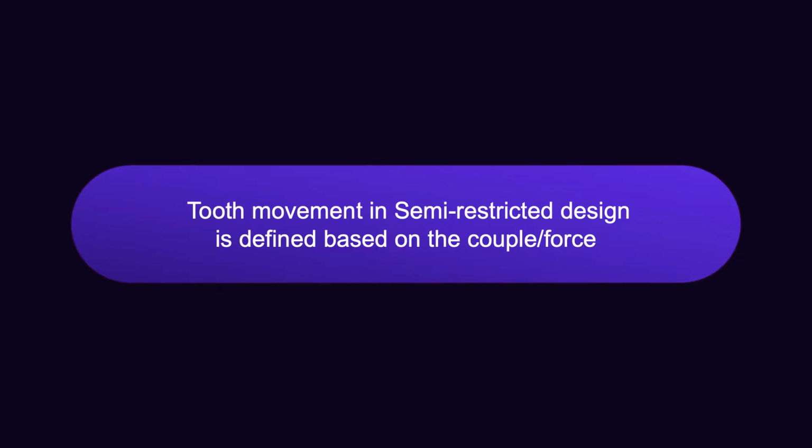As you can see, the type of movement in semi-restricted design is not based on the relation between line of action and center of resistance. It depends on the couple to force ratio.